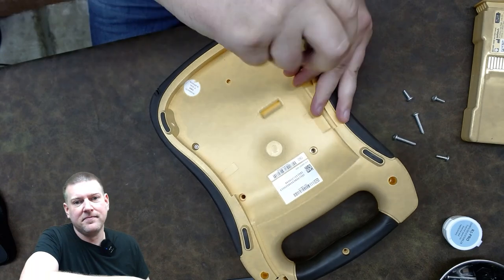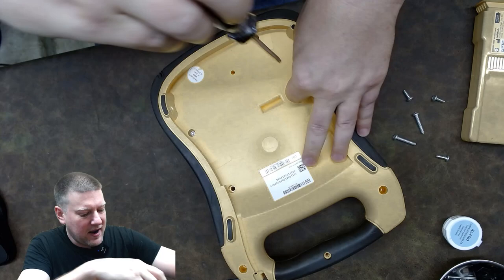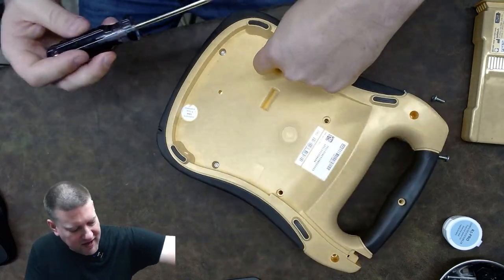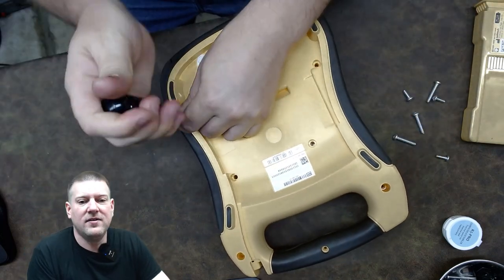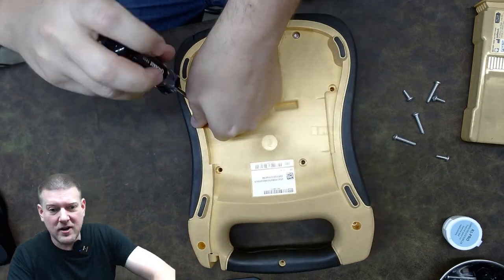And there's the infamous 'warranty void if tampered' sticker, which according to the Magnuson-Moss Act is illegal. They have to prove that if this unit stops working, it's because of something I did — not simply because I opened it up.